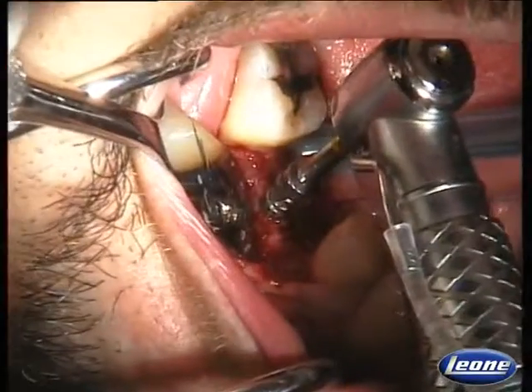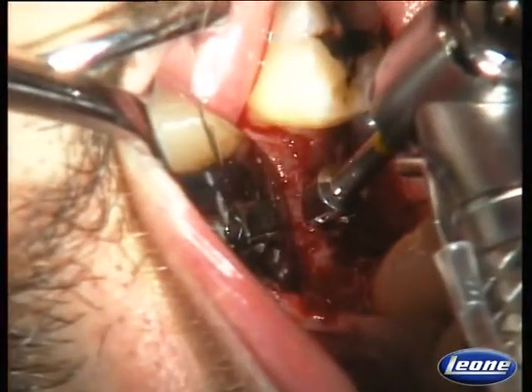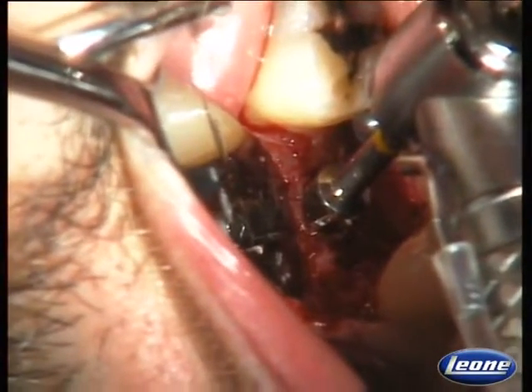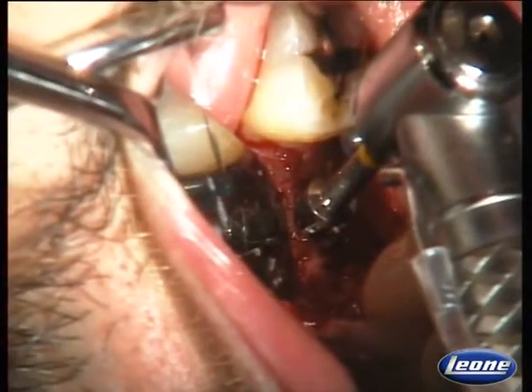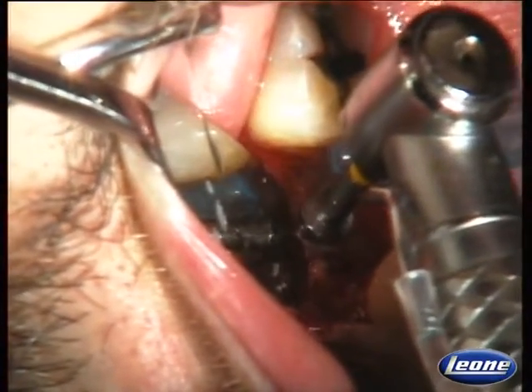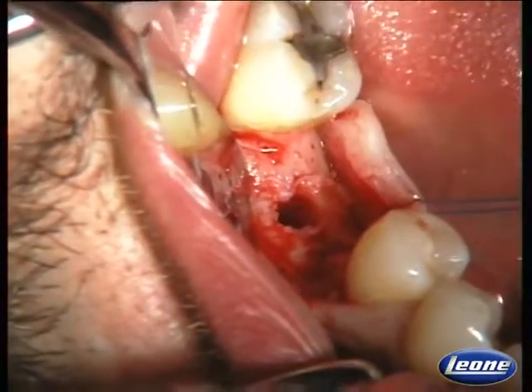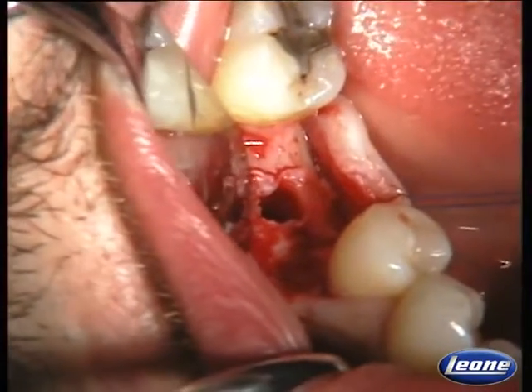We place the cylindrical portion of the countersink into the prepared hole. As you can see, there is about 1 millimeter up to the reference mark. We start drilling. That's it. We have shaped the implant site for the implant neck. Now we are ready to place the implant.